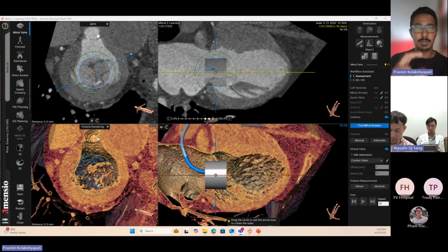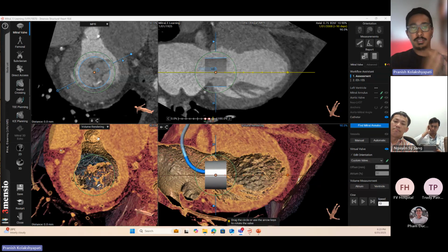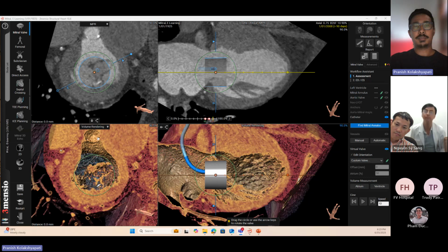So there's a valve in valve app you can download, and you can design your measurements with respect to that valve. We work closely with the designers of that app, so I'll send you the details of the app. You can have all the details of the previous valve and what valve we're going to use. Everything will be in that app. It's a free app.